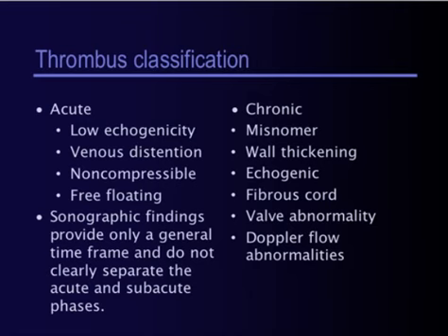Over time, the vein lumen may decrease in diameter, and this is in the subacute setting. Thrombus will no longer be free-floating, but become adherent to the vein. Recanalization may be occurring, and collateral veins may be seen. The one misconception is that collateral veins take time to develop, and that is actually not true. Collateral veins can often be seen immediately after acute thrombosis. In the subacute setting, collateral veins may continue to enlarge.